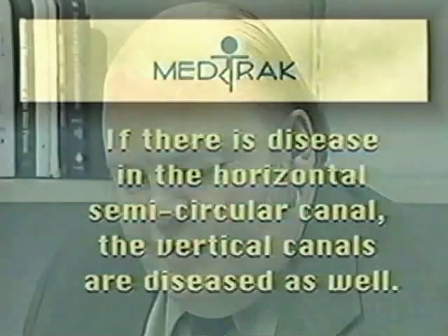Before beginning this test, it is of primary importance to make sure that the ear canals are cleared of cerumen and that the eardrum is unobstructed for stimulation with the cool or warm water or air. In addition, it should be determined at the time of the pre-testing examination whether or not infection in the skin of the ear canal or a perforation of the tympanic membrane may be present.